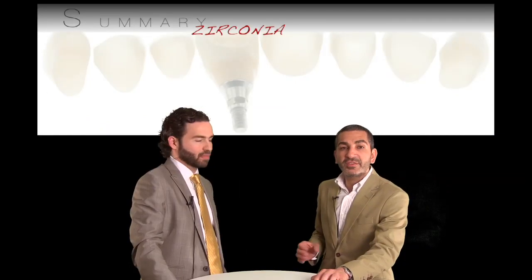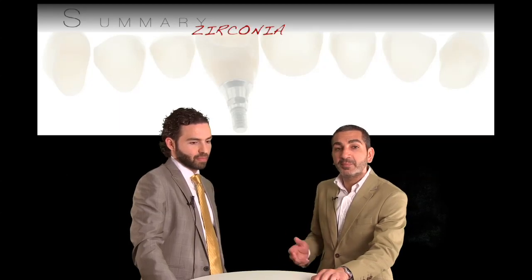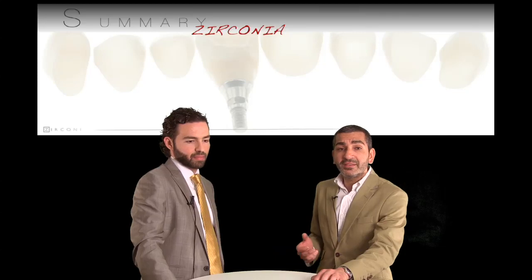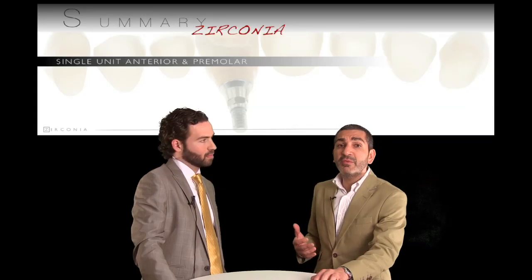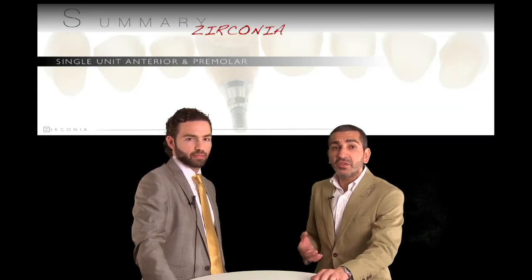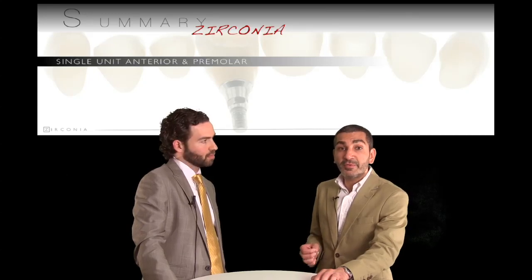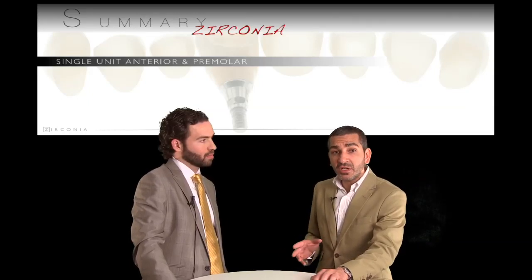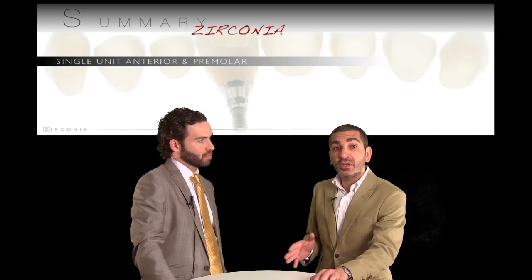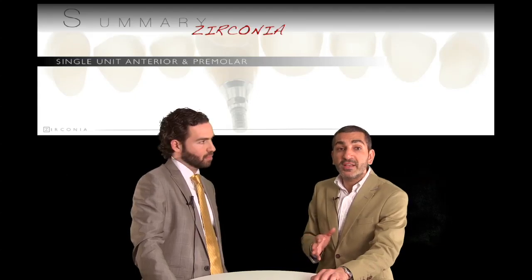Let's summarize zirconia restorations. When is the best time to use them? What is the best place to use them? Well, we've talked about this, and the summary is that they really should only be used on anterior teeth, incisors, or maybe even premolars. But as we go back posteriorly to the molar region, we start getting more incidence of chipping. So if we really want to use them on those posterior teeth, we should really consider proper framework design, support for the ceramic as much as we can in all different areas. In addition, please also consider the all-in-Z option, where the whole restoration is made out of pure zirconia, polished or glazed, or both.